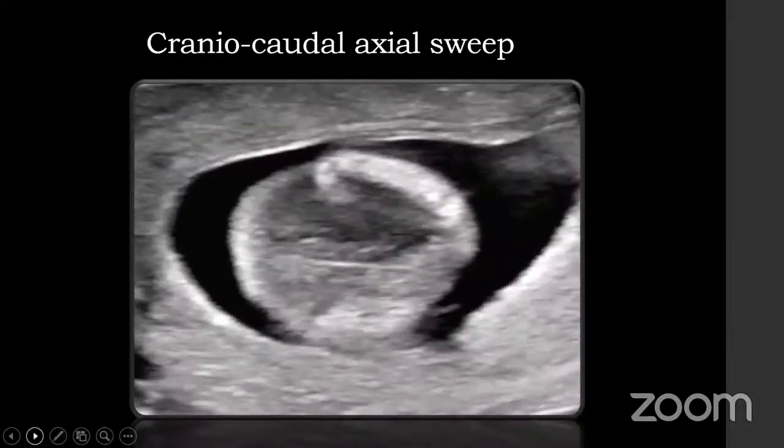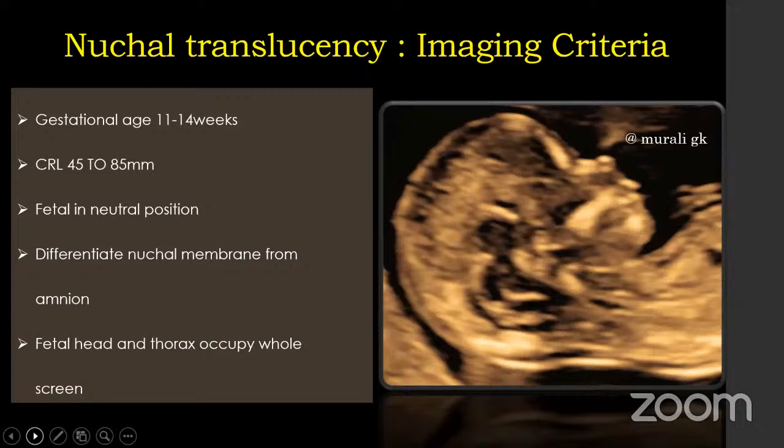Now from the axial, we move on to sagittal. This is a very familiar picture, what we all take during an NT scan. I don't want to go into the details. What I want to see is you are seeing the nasal bone, the skin, the nasal tip, the maxilla. Then you are seeing the diencephalon, the brainstem, the choroid plexus, the fourth ventricle, the intracranial cisterna magna, and the intracranial translucency.